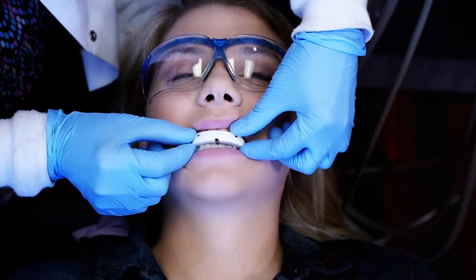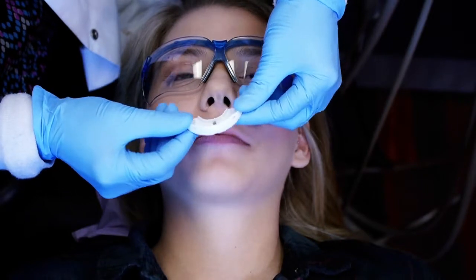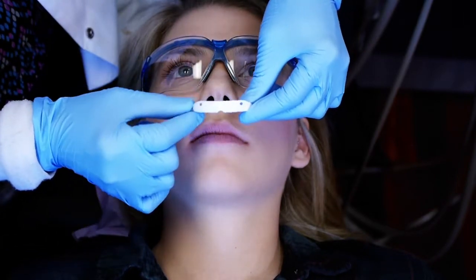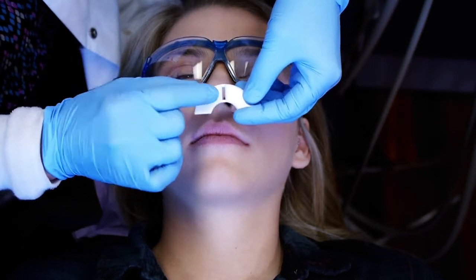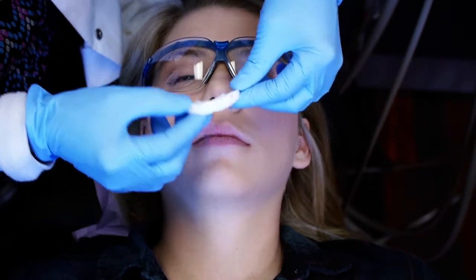So what I'm doing with my QuickSplint, I'm going to have you open for me, Jenna, is when we think about the QuickSplint, you can see that it's just a little prefabricated shell. It actually has two little holes in it that help us with retention of the material that we're going to use to custom fit it. It also has another slit in the anterior, right at the midline, again designed so that we can get retention of the material. And what I want to do first is I'm going to just try it in.